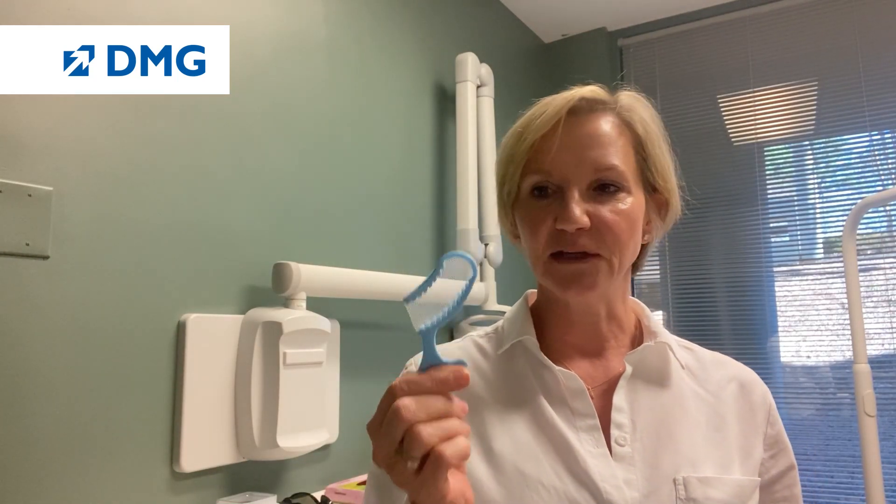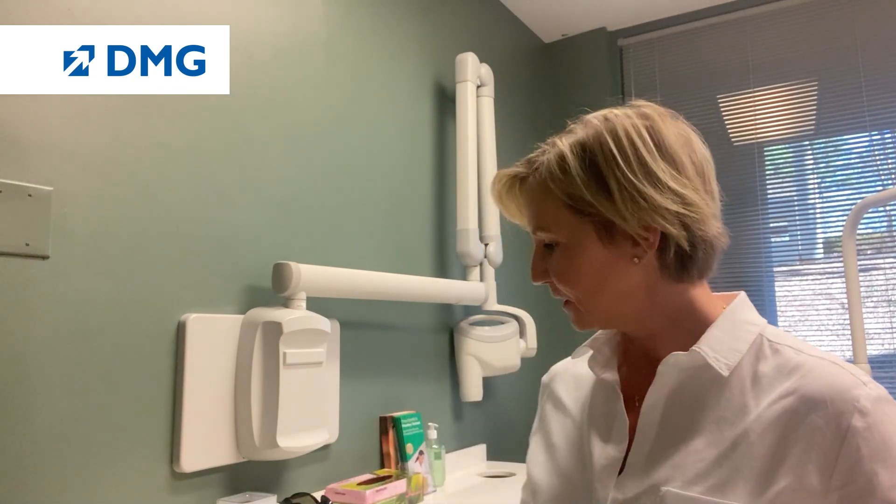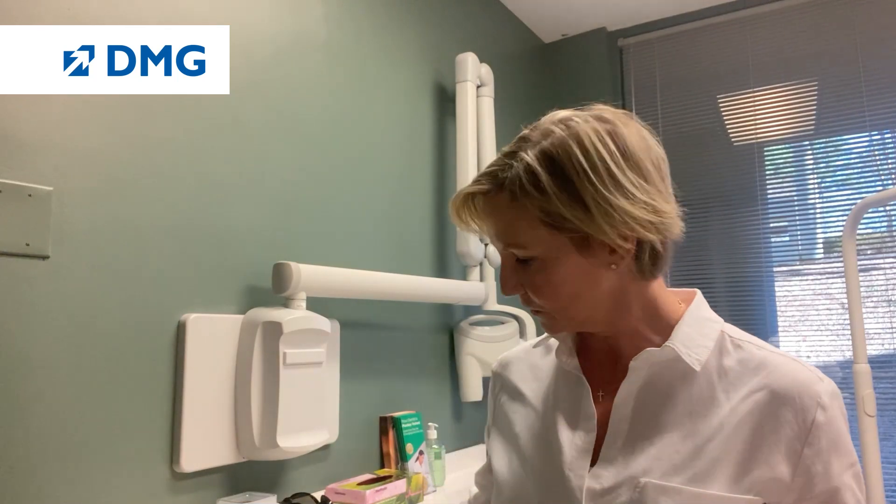So I encourage you to pick it up. Usually what I do, very simply, is have the patient bite into a little quarter tray with a little bite registration material. That's my mold for the provisional. We use Luxatemp, place it into the mold, place it against the tooth structure, and have the patient bite into that.